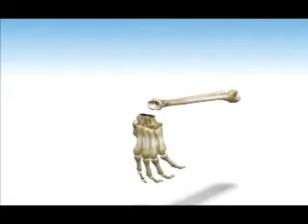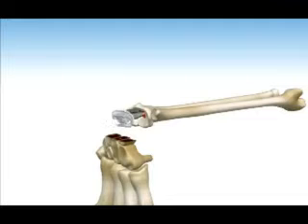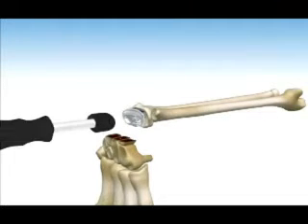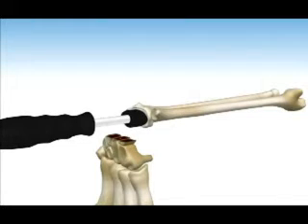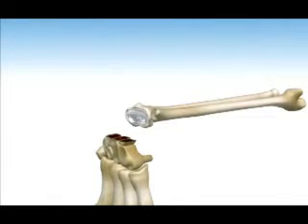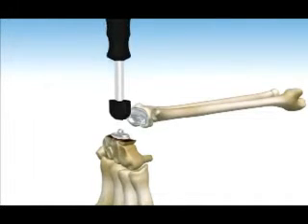Step 6. Insert the radial implant and press fit in place. Using the radial impactor, tap the implant until fully seated. In treating patients with osteoporotic bone, bone graft or cement may be used. Insert carpal component and press fit. It is aligned with the centering hole in the capitate and pushed or tapped into place.